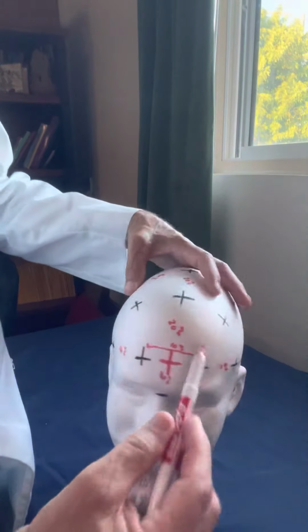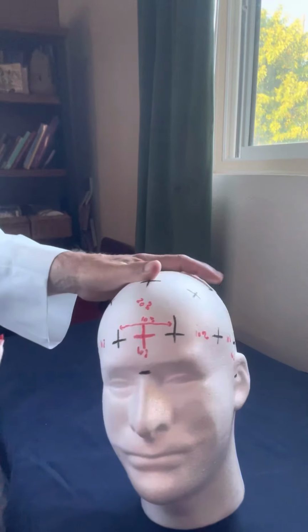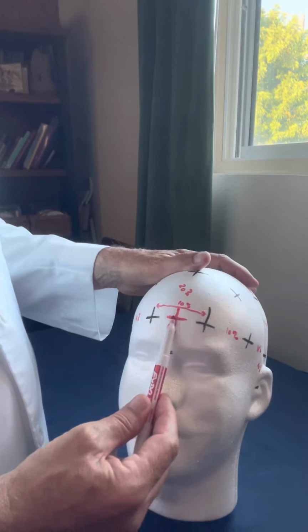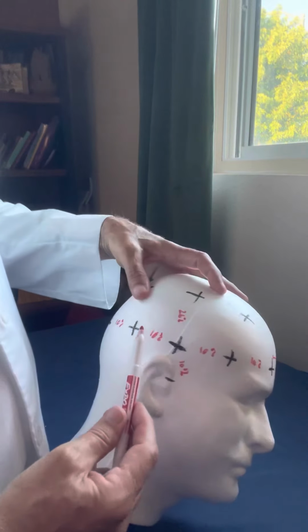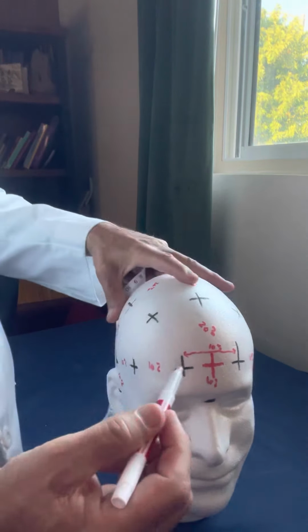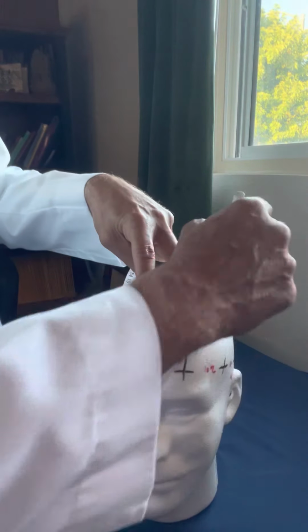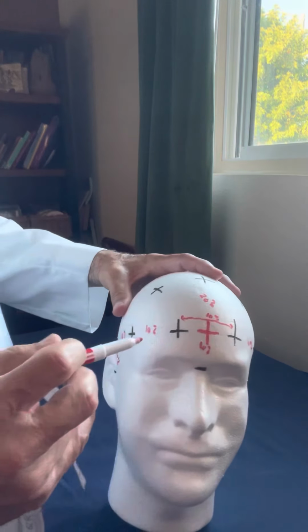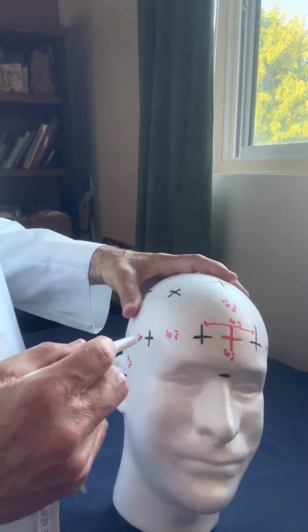Now if you add up all the percentages around the circumference of the head, it'll equal 100% of the circumferential distance. So 10, 20, 30, 40, 50, 60, 70, 80, 90, and 100. Again, between each electrode on the circumference of the head, going around the bottom of the head in a circle, or an oval, it should be 10% of the circumferential distance between each electrode. In this case, it should be 5.5 centimeters.